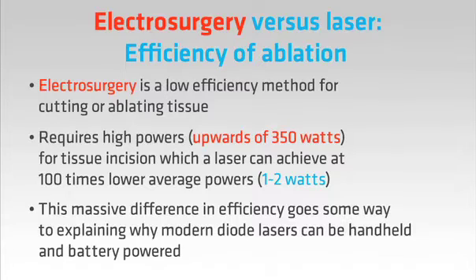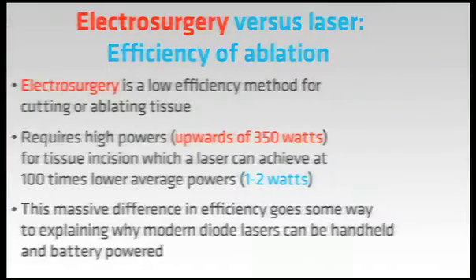This massive difference in efficiency helps to explain why a modern diode laser can be handheld and battery powered and used in your practice as a replacement for many things that you previously would have done with electrosurgery.